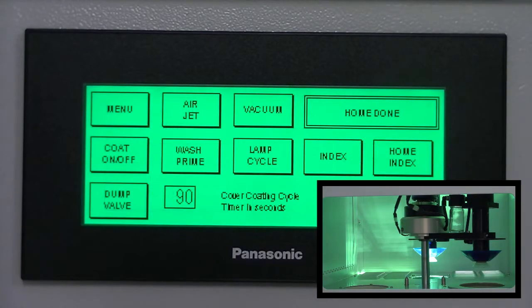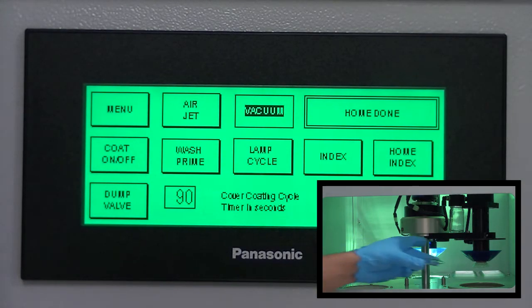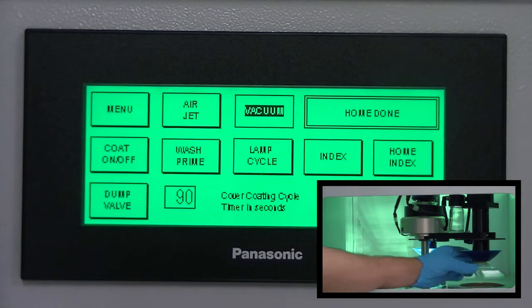Starting at the main menu, press machine setup. Press the vacuum button. Place an uncoated sample lens on the suction cup over the wash bowl.